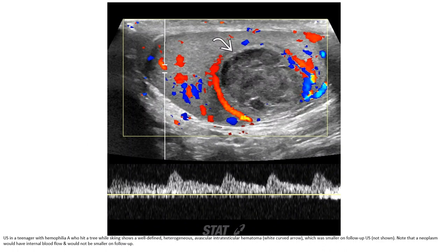Ultrasound in a teenager with hemophilia who hit a tree while skiing shows a well-defined heterogeneous, avascular intratesticular hematoma, which was smaller on follow-up ultrasound. Note that a neoplasm would have internal blood flow and would not be smaller on follow-up.